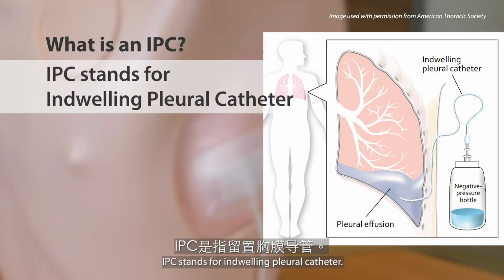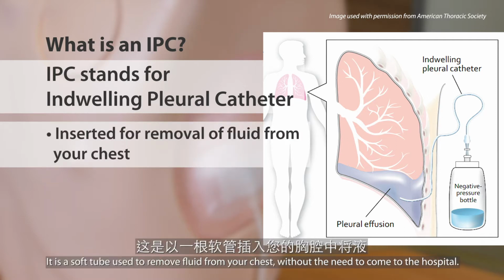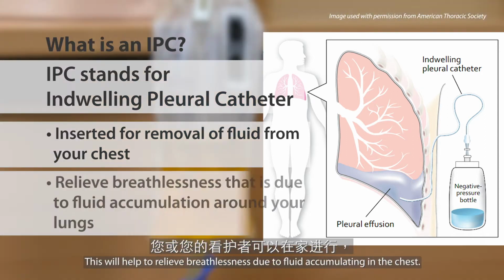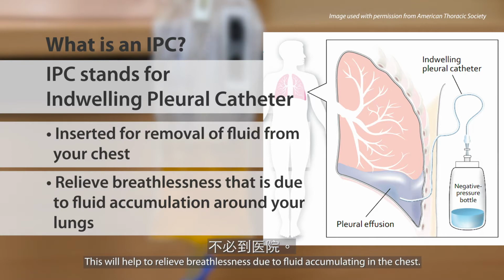IPC stands for indwelling pleural catheter. It is a soft tube used to remove fluid from your chest without the need to come to the hospital. Removing or draining the fluid can be easily performed by you or your caregiver. This will help to relieve breathlessness due to fluid accumulating in the chest.